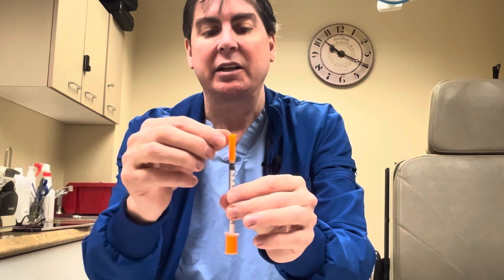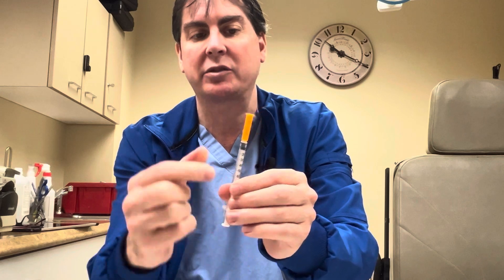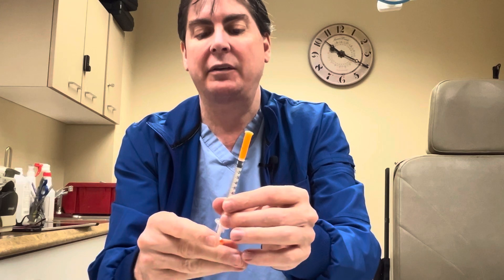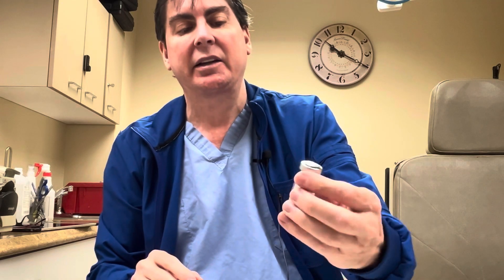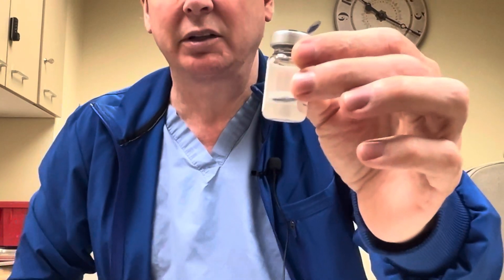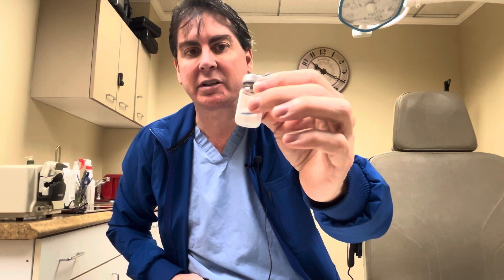Keep in mind the syringe has two orange caps. You take one off here to withdraw and the other covers the needle. With the semaglutide, it is not full to the top even in a brand new vial — it really only comes about twenty to twenty-five percent filled and that's a full portion.